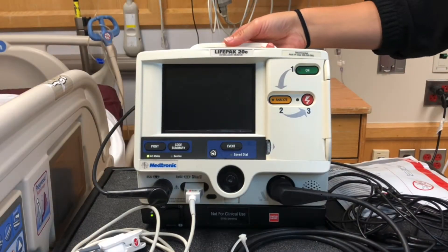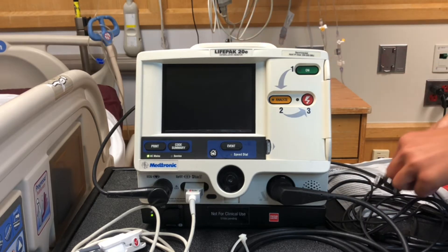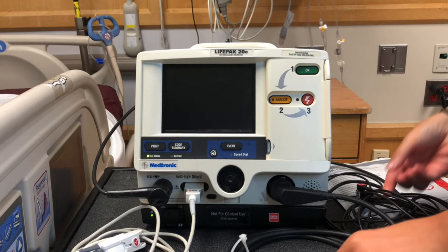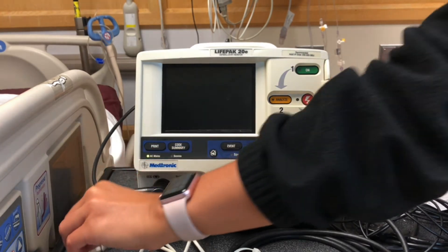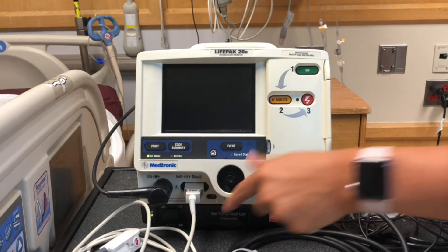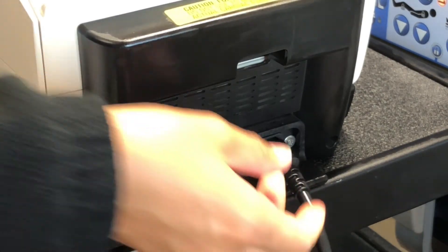This is a LifePak 20E. There's a handle on top to carry it. There are three-lead ECG wires, a therapy cable to connect the quick combo pads, and a pulse ox cable. There's also a place to connect end-tidal capnography. The power cable gets plugged in at the back of the LifePak 20E right here.